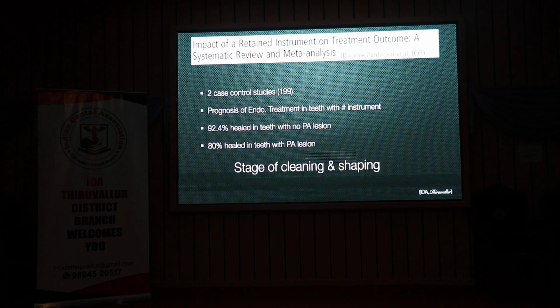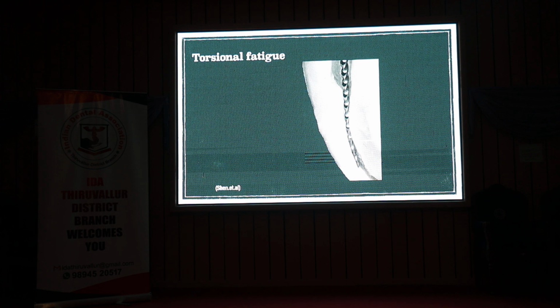So it's not that you can quote that instrument and say, no, it's not going to fail. So we have to prevent instrument separation, or if there is an instrument separation, at least in some of those simple cases, manage it. Before going into that, just a little bit about how the instrument fractures inside.